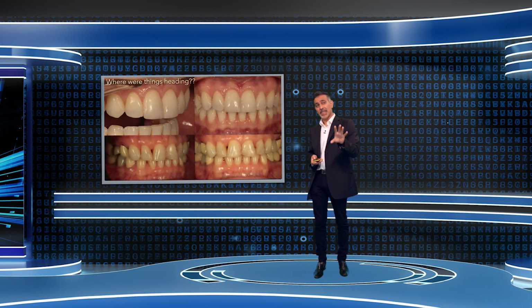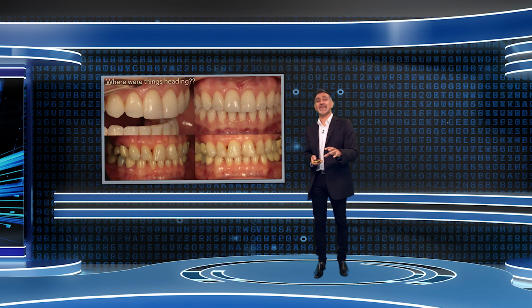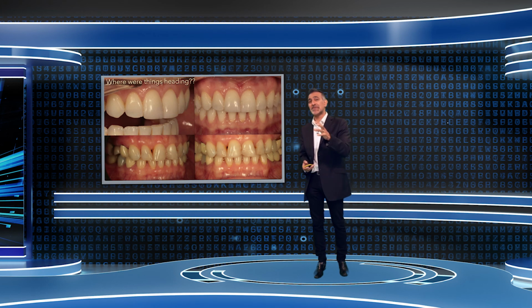So this is the patient technically, who knows, in 20, 30 years with more mesiopalatal rotation, more loss of anterior guidance, loads of crowns in the back of teeth. Yes, we don't know that's absolutely going to happen, but you often see a pattern like this emerge. I know because I've improved this patient's upper anterior guidance. She's got an upper retainer, obviously an upper Essix retainer as well. We're already talking about doing edge bonding on those lower incisors. I'm going to probably open her slightly.